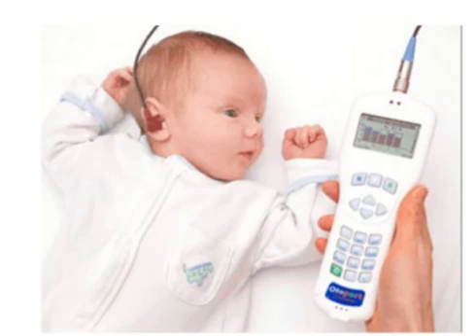OAE are also very sensitive in detecting mild hearing impairment. Damage to the outer hair cells from noise trauma or ototoxic medications can appear on OAE before presenting on an audiogram. When OAE are absent, there must be some dysfunction in the cochlea, although the degree of hearing loss is uncertain.